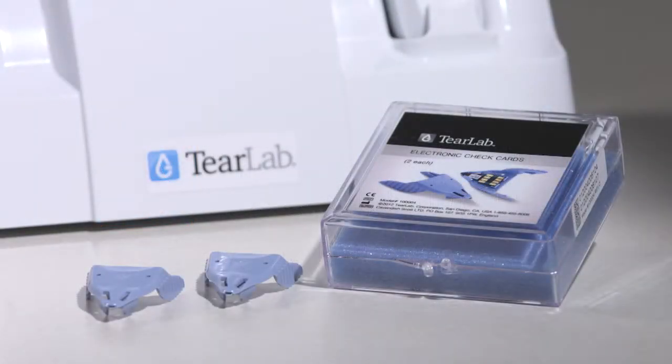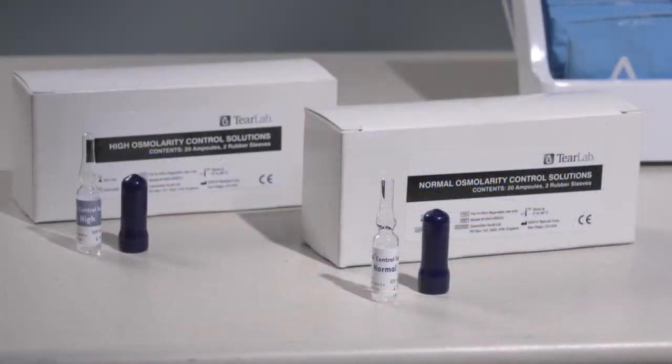The first quality control test you should perform each day is the electronic check card test using the blue reusable check card. The second quality control test to perform on a monthly basis is the Osmolarity Control Solutions test.